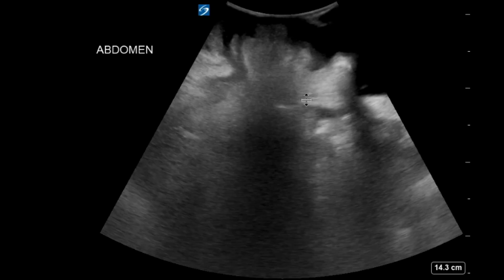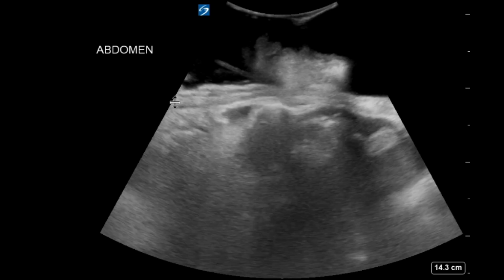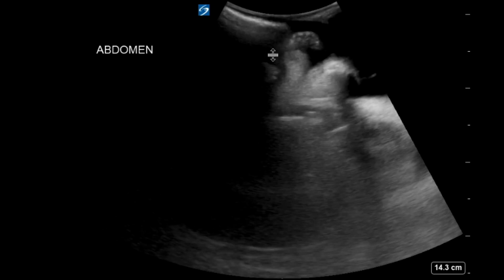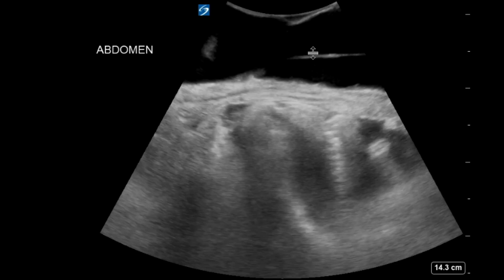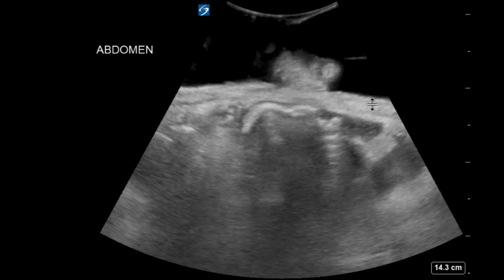See it again in another view. This right here is basically the lining of the abdominal wall and then bowel prolapsing out into that. So this was a non-strangulated hernia, was easily reducible, and he ended up getting discharged.